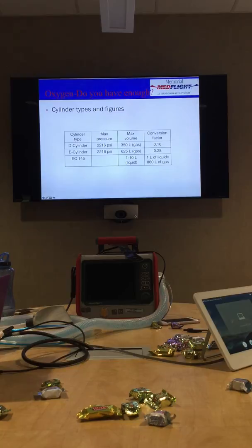I have a patient that I'm going to run at 15 liters. First you need to convert it from LOX to gas. So you take that 5.4 and multiply it by 860. After you get that, which ends up being 4644, you divide it by your 15 and you get 309.6 minutes, which is actually a little over 5 hours.